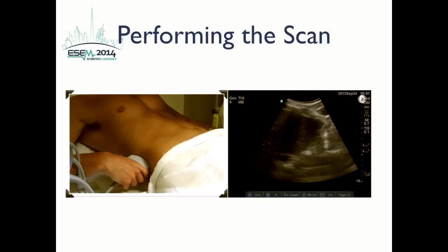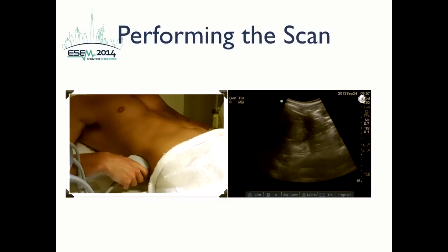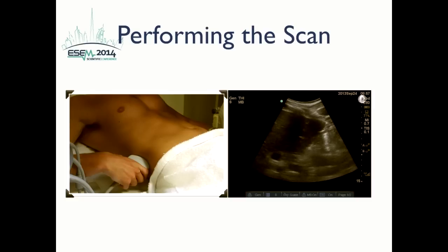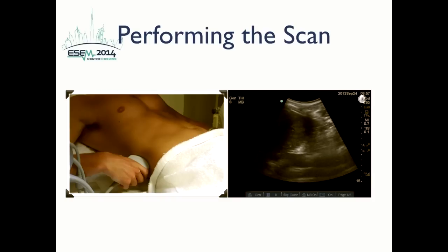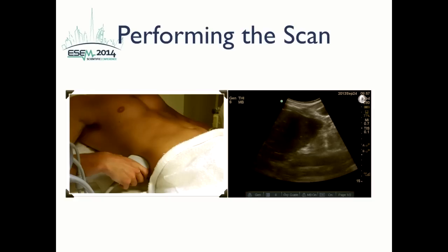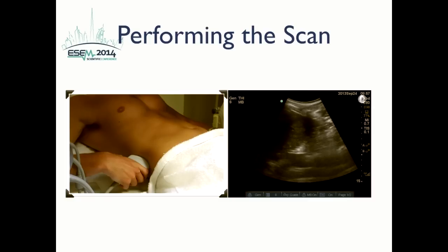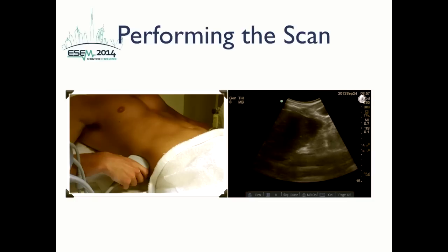A second approach is to scan the liver as an acoustic window by placing the probe in the right anterior mid-axillary line, similar to the placement of Morrison's pouch. With the marker pointing towards the patient's head, by scanning more anteriorly and cephalad than the Morrison's pouch view, the IVC can be visualized running longitudinally adjacent to the liver and crossing the diaphragm. When two vessels run parallel and it may be difficult to distinguish aorta from IVC, following the vessel to the chest is the more useful technique, though placing Doppler can also be helpful. The sub-xiphoid approach is most commonly referenced in the literature.